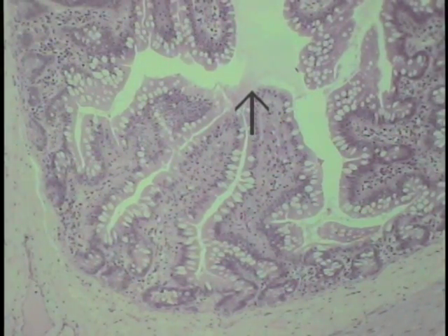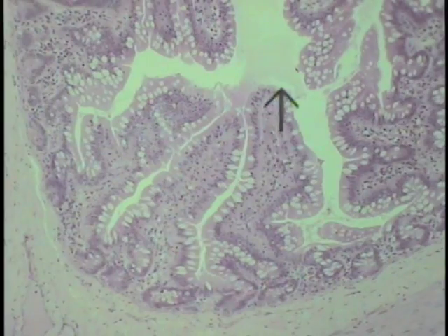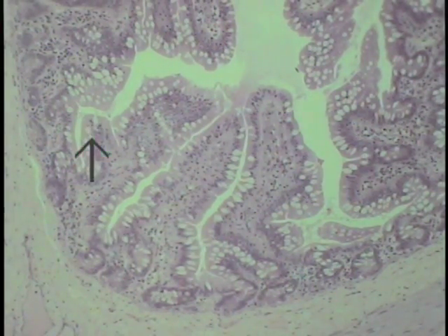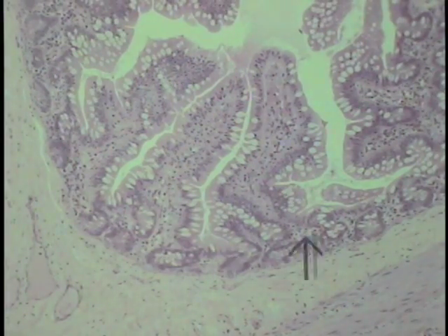This is a section through the ileum, further down the intestinal tract. Intestinal lumen is shown at this particular location. Here's an intestinal villus shown here, another intestinal villus shown here, and another one here. Note that the general architecture of the mucosa is becoming thinner, though the elements still remain, that is the villi and the intestinal glands, or crypts of Lieberkuhn, although they are much shorter.